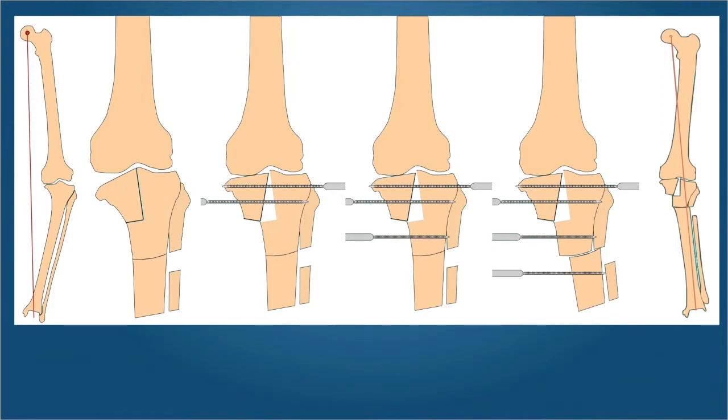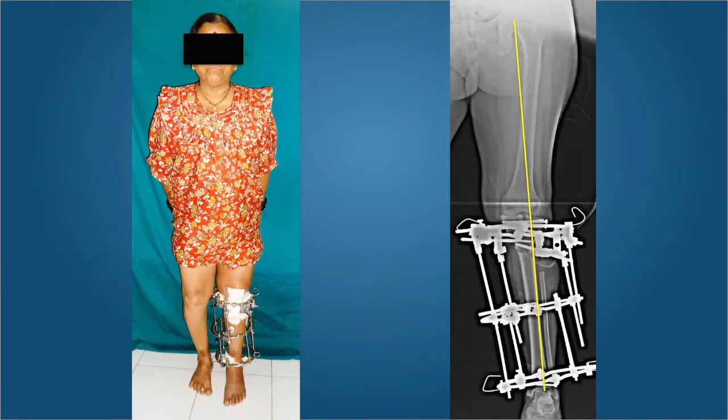So here she is with the Ilizarov fixator. Just the one ring fixes the intra-articular as well as the intervening fragment with 2 half pins. The intervening fragment may have thinner half pins like the pediatric ones. The shank is 6 mm, but the threaded part tapers from 4 to 3 rather than 5 to 4, so that you're not fighting for real estate.